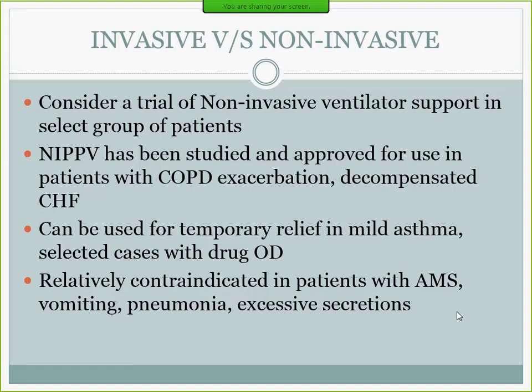So these are some of the things that you need to monitor. End-tidal CO2, of course, your oxygenation, your pressures, your peak airway pressure and your plateau airway pressure. Because remember, if you are on call in the middle of the night and the patient is doing well and suddenly peak airway pressure starts rising, you go to the bedside and you do this maneuver, difference between peak and plateau pressure, and you find a big difference, you know there is something wrong with the resistance, something wrong with the airway.